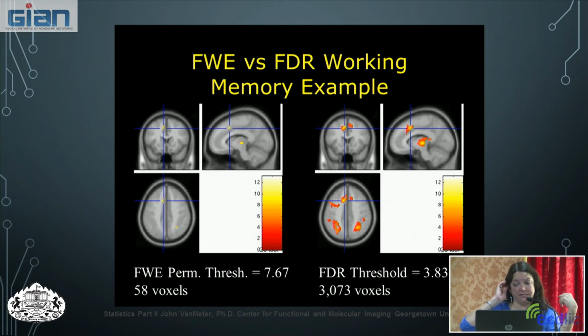Whereas if we use the same technique with our false discovery rate threshold, and we stopped at a p, or so the t and the p values are sort of similar because we have the same number of experiments, so we can take p to t and t to p back for a fixed number of scans or a fixed degree of freedom. So it's also like we order our t values and we say anything below a certain adjusted point we're not going to consider active anymore.